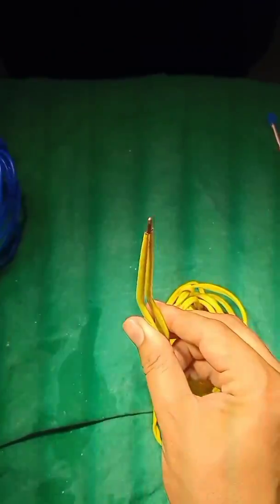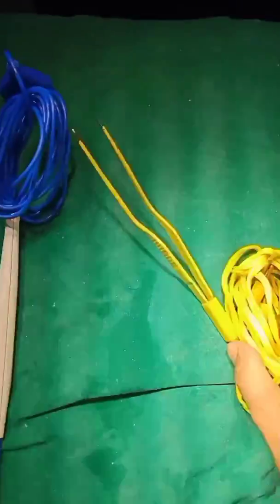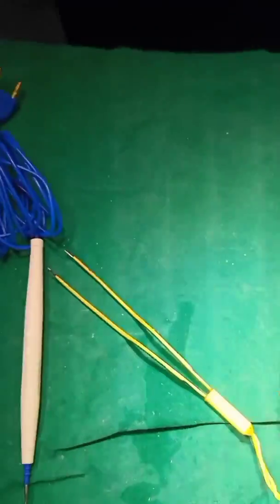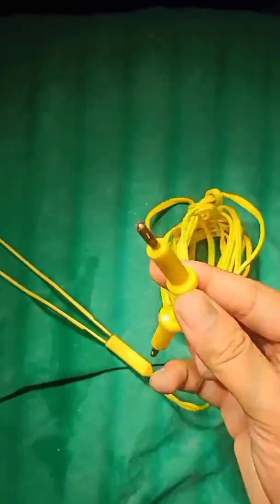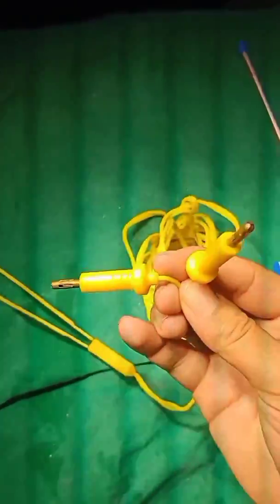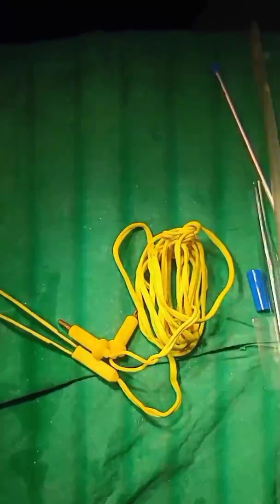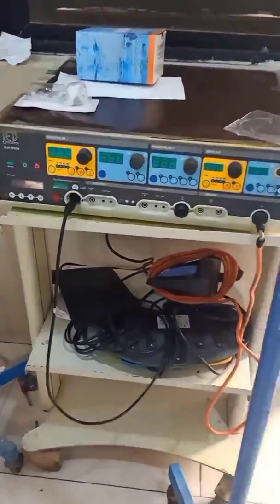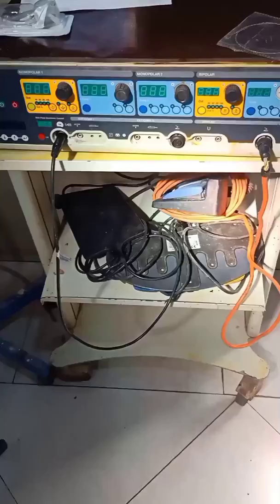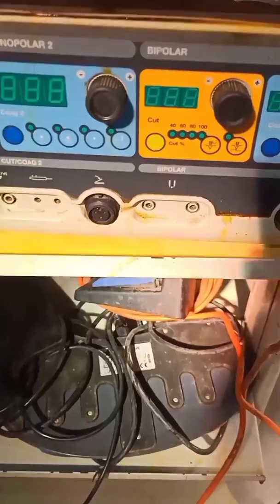In the closer view, you are now seeing the bipolar cautery on your screen. It has two prongs. It is better compared to unipolar cautery because the current precisely flows between its two prongs, causing less surrounding tissue damage.